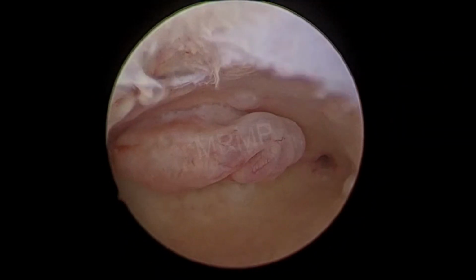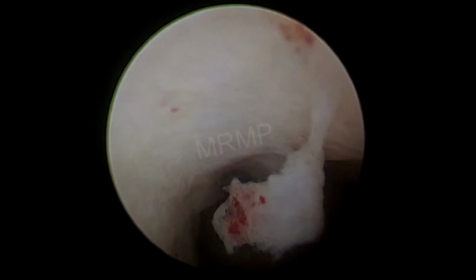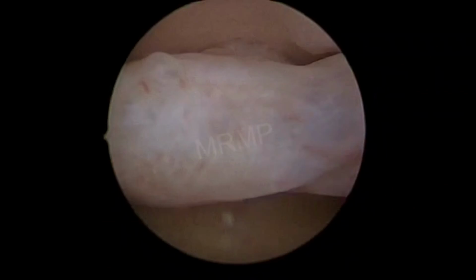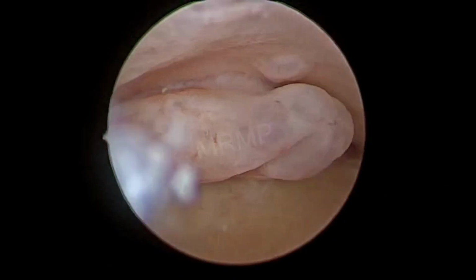Initially, the hysteroscope is introduced under direct vision and the cavity is assessed: the anterior wall, the posterior wall, both the ostia, and the presence of the polyp with a stalk, smooth surface, visible stroma, and vascular pattern, which confirm the sonographic findings.